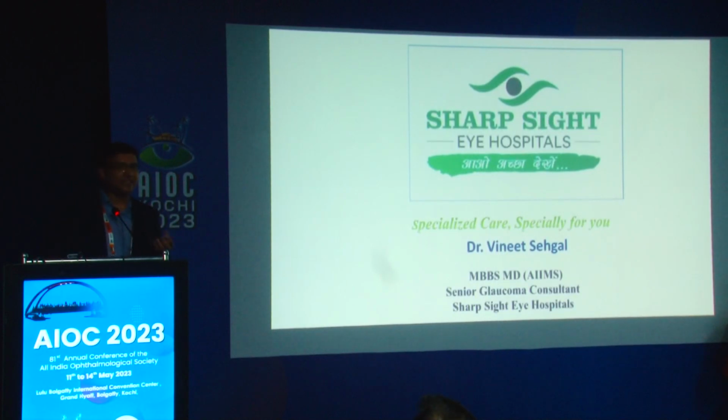The recent patient that I did was referred to me by her, sir. The patient wanted to get the micropulse laser done because he was not very keen to get the GDD done, as his marriage was on 5th of May. So he just wanted 15, 20 days, 30 days, 35 days, whatever the period, I can get just 2 or 3 millimeter pressure control, and then when everything goes back, unfortunately even for one day the pressure was not down, so it was the same.